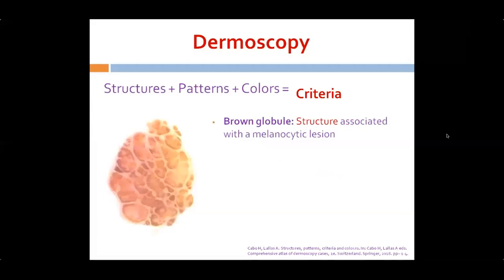So to conclude, I'll talk about certain advantages of dermoscopy. It's a non-invasive, quick, office-based and OPD-based procedure, very easy to perform. And the most distinctive advantage it offers is the in vivo visualization of skin subsurface structures. As discussed earlier, it helps in early decision on biopsy or excision, especially in malignant lesions.